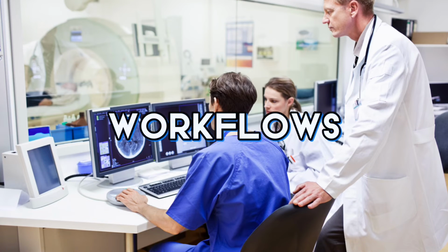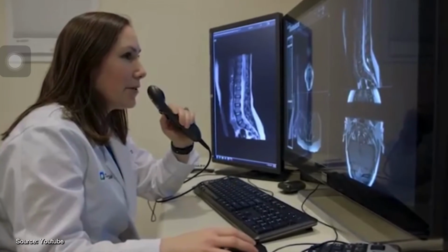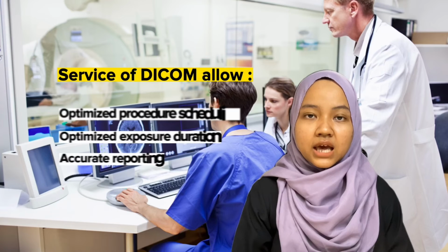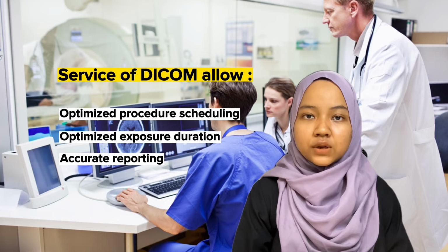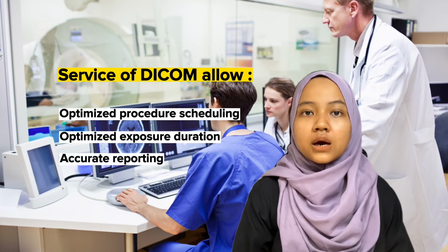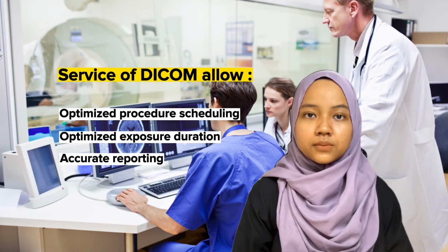The second is workflows. It can manage the workflows using the system's interoperability, which is enabled by Dicom. The workflow involves producing, storing, displaying, querying, processing, retrieving and printing medical images. Additionally, optimized procedure scheduling, exposure durations, and accurate reporting about workflow are allowed by the services of Dicom.